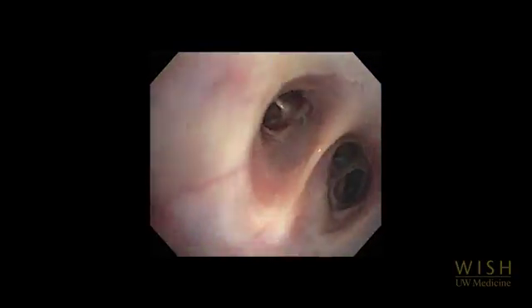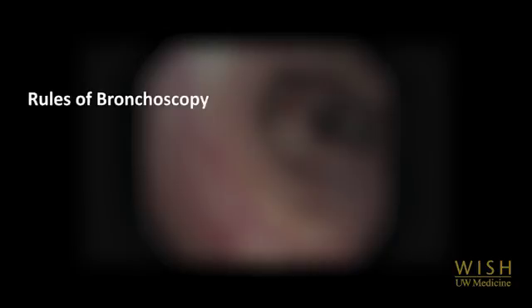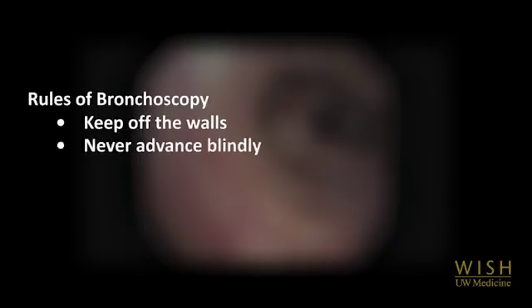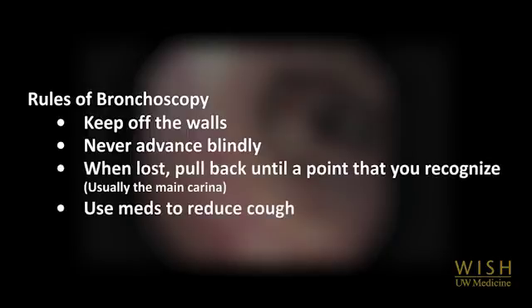These airways are inspected so that the sub-segmental carinae have been viewed, and then the bronchoscopy is complete. There are a number of normal variations in the anatomy of the airways — you will become familiar with these as you practice. In this presentation, we have demonstrated the most common airway anatomy and illustrated the rules of bronchoscopy: keep off the walls, never advance blindly, when lost pull back until the point that you recognize, and use medications to reduce cough.